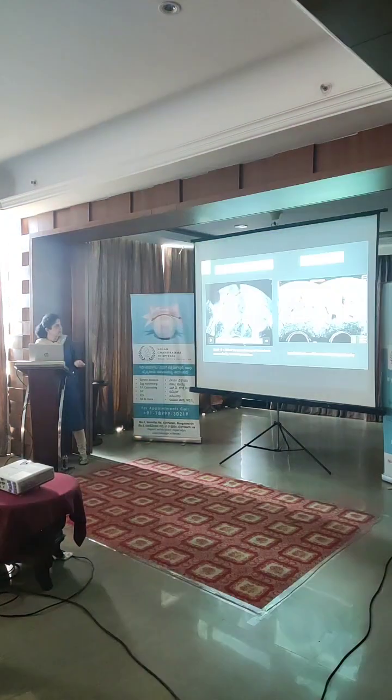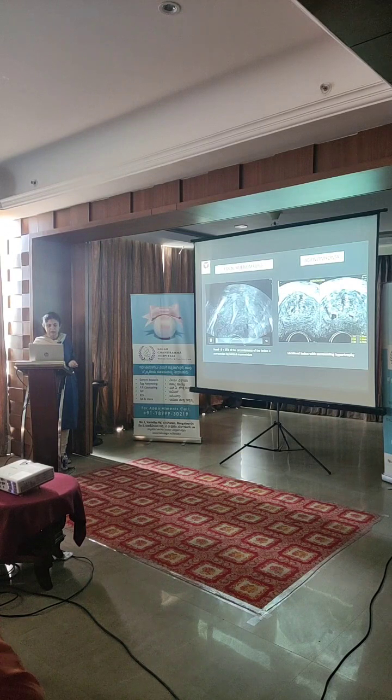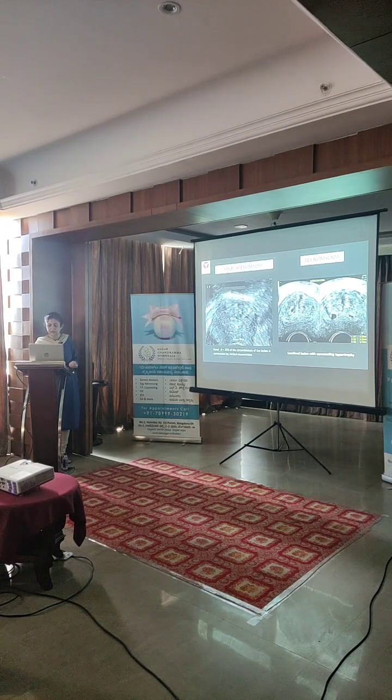So if you look at this, this is an adenomyoma, and this was focal adenomyosis. And oh, now it decided to move. Okay. And I'm going to stop this now. So that is the focal adenomyosis, and that is an adenomyoma.